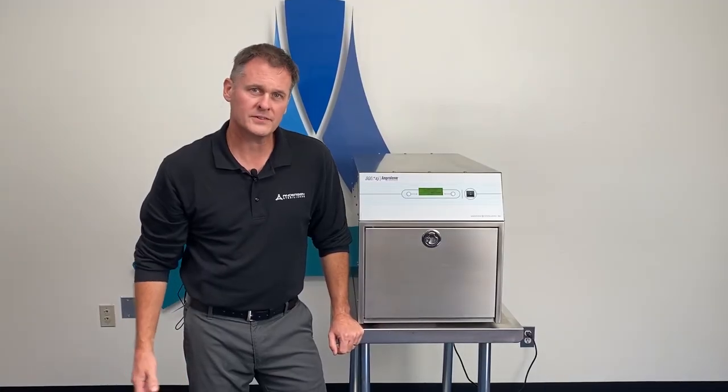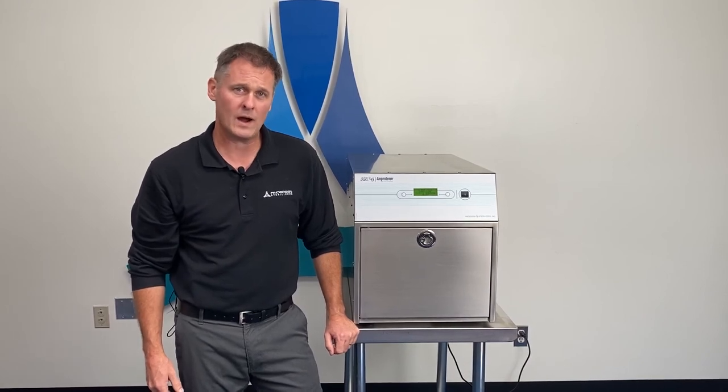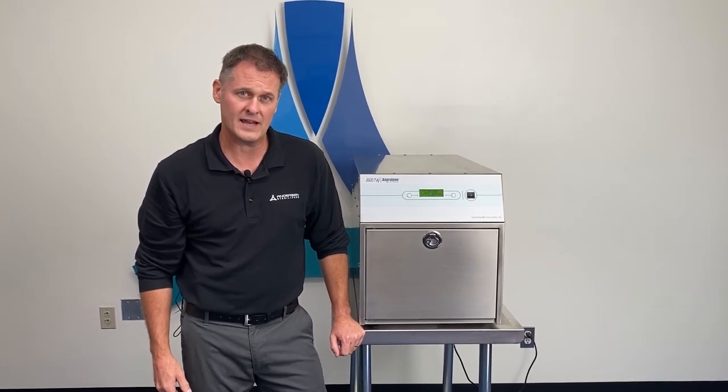At this point, the sterilization process has begun and the sterilizer will count down from either 12 or 24 hours depending on what cycle you chose. Thanks again for watching the loading process of the AN74J Sterilizer.